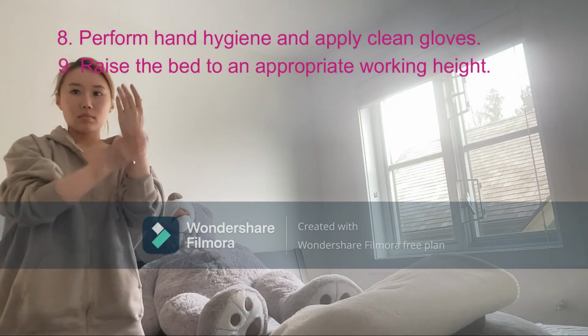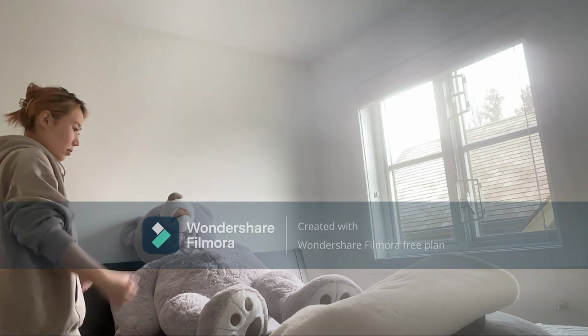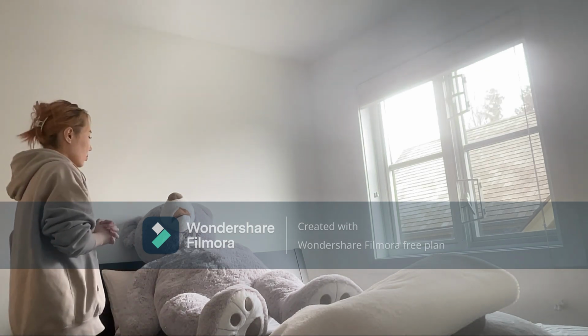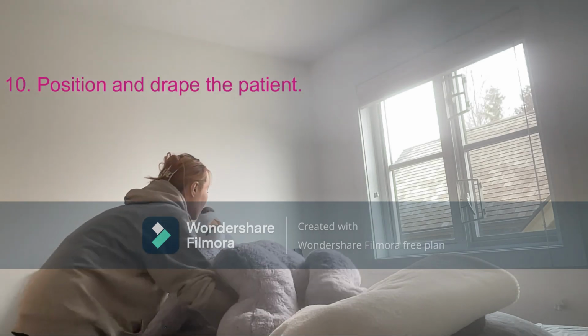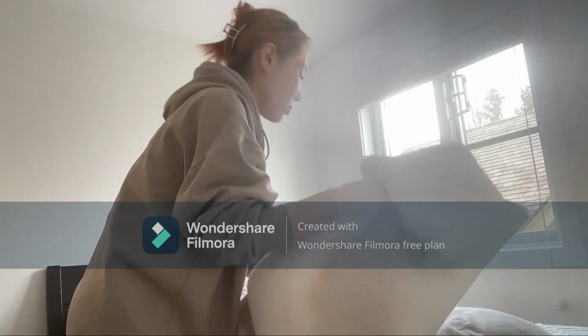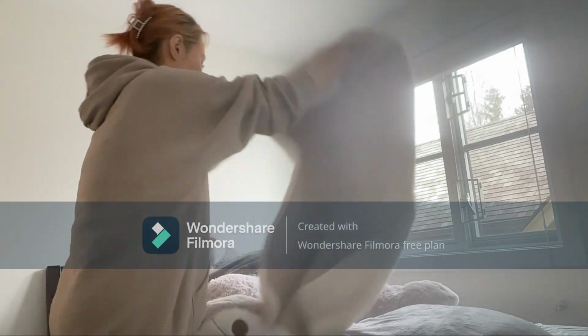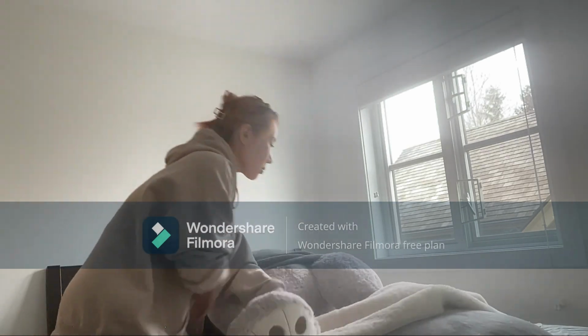Raise the bed to a comfortable working height and lower the rail on the working side. Okay, Mrs. P, I'm going to lower the head of the bed just a little bit. I'm going to go ahead and pull your covers back, and I will drape you with the blanket. Drape the patient for privacy, and ensure that there is a waterproof pad under her. Help her into the dorsal recumbent position, lying on her back with her knees flexed.